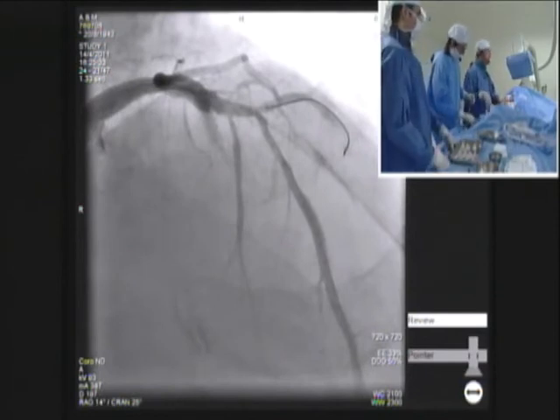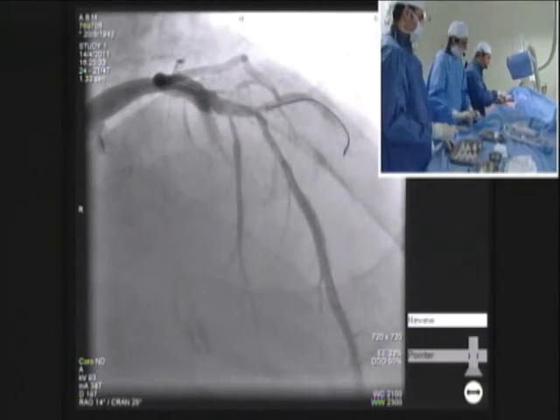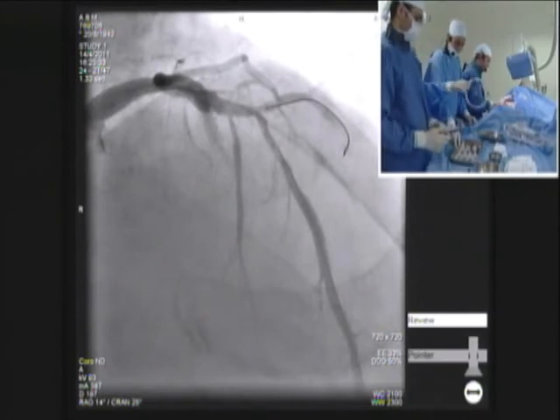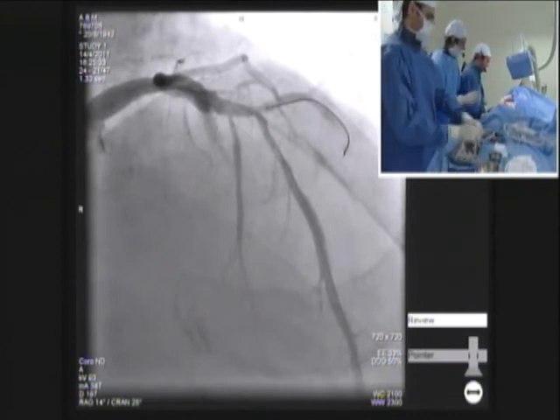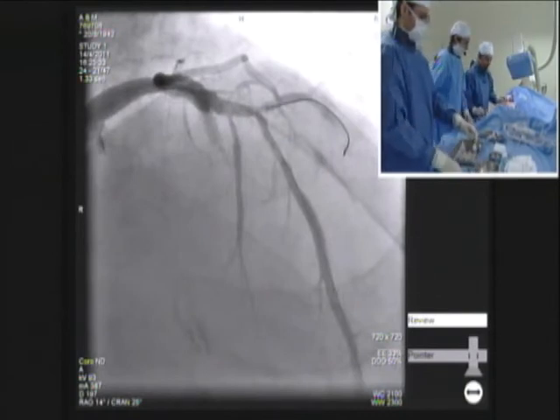So you did pre-dilatation with a 2.5 balloon? With a 2.5 balloon. So the 2.5 or 2.0, Alex? 2.5. I thought that there was a lot of fibrosis, irregular, a little bit of calcium, so I decided to go a little bit more aggressive, perhaps. But I think the IVUS discussion is an interesting one.